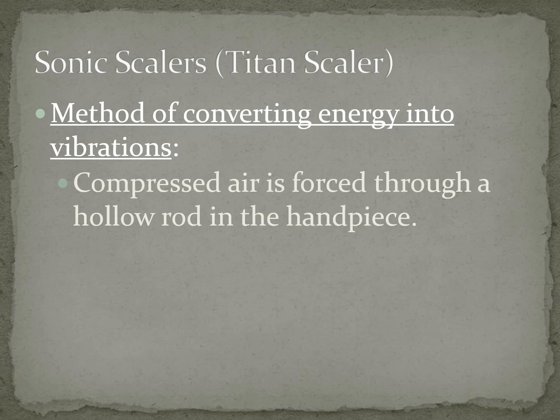So how do they work? They work by using compressed air, and it's going to be forced through a hollow rod into a handpiece. So just like when you're polishing, right? You put your polisher on, you push Profi angle on your slow speed and you polish. Okay, so that compressed air is going to be passed over a series of metal plates, and it's going to cause vibrations that are going to be transferred to that sonic tip, and that is what's going to cause it to move.